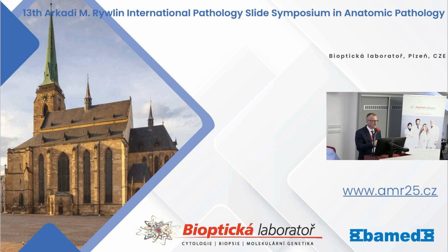Or if you let the AI think for itself and just say, these are carcinoma, these are benign, and work it out. Even this training is possible, but you get different results, sometimes interesting, but nothing is possible without your eye and your final diagnosis. If you sign out something like that, then God bless you, because you will need him.